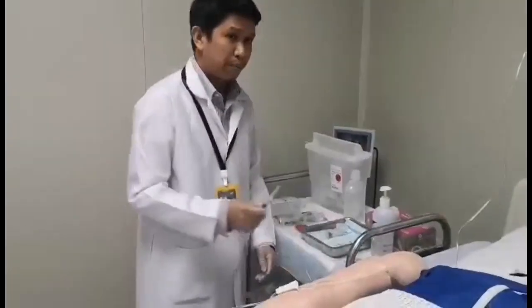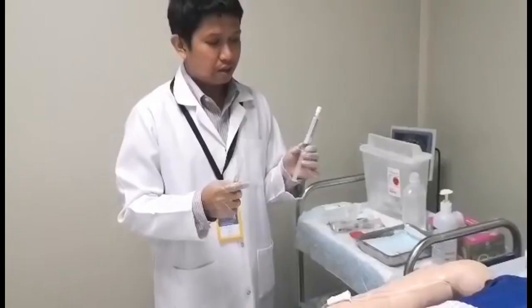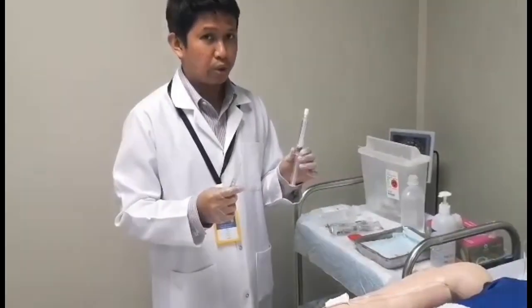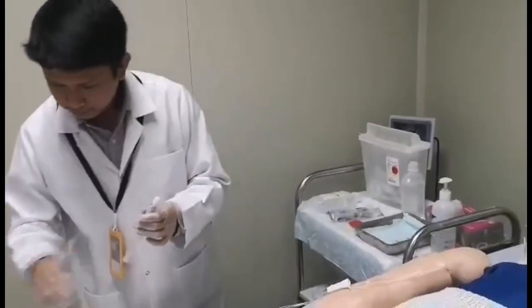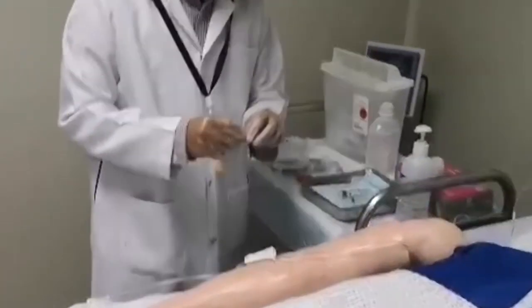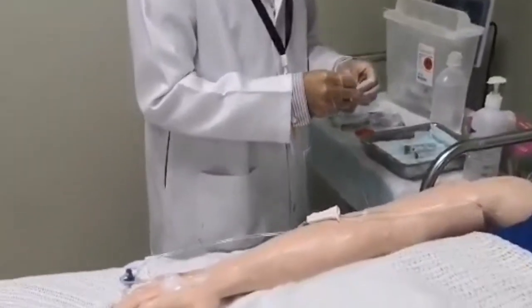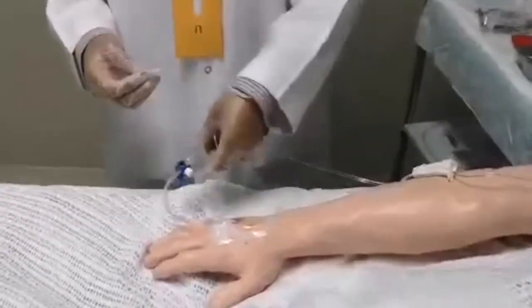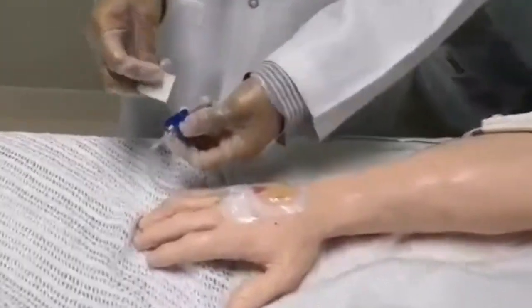The first step is to prepare the medication using the correct syringe — a 10 ml normal saline flush, which is commercially available. Using an alcohol swab, clean the injection port on the three-way saline lock.